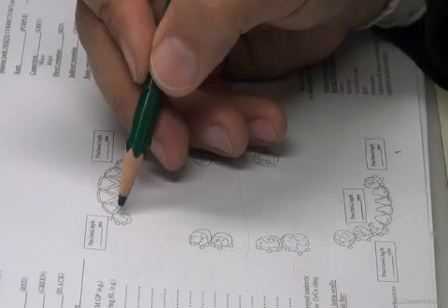In major connector, did we change it? Palatal strap. Okay. In palatal strap can be left open away from the cingulum rest, or as we told you later on, fill it in with a plate. You're okay. Both options are valid.